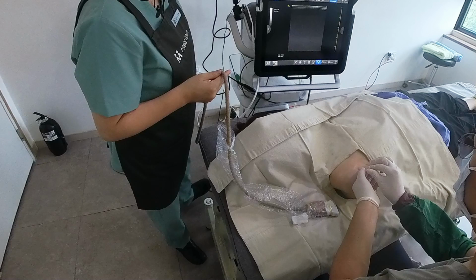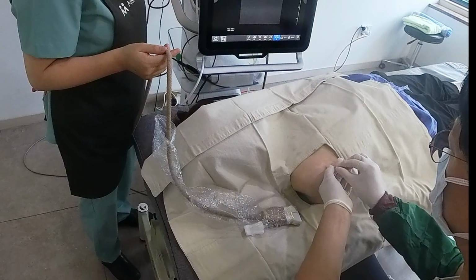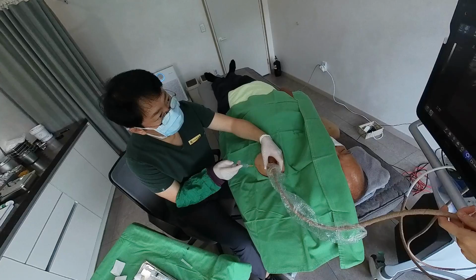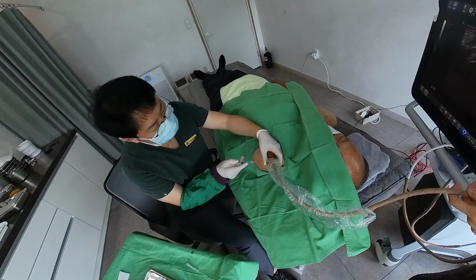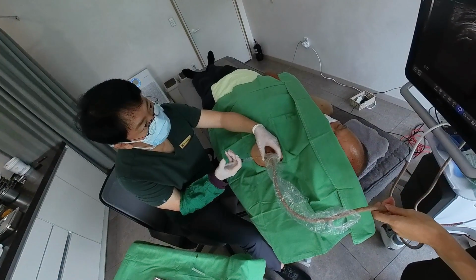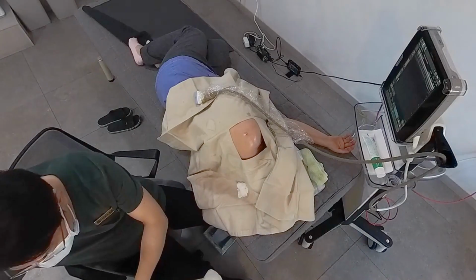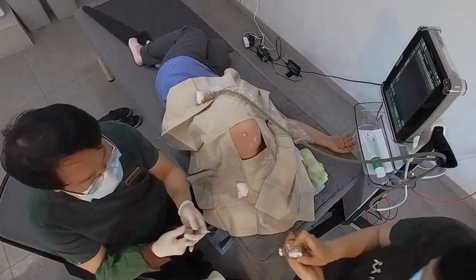Procedure steps. Patient positioning. Depending on the lesion's location, place the patient in the appropriate position. External rotation for subscapular lesions, internal rotation for anterior supraspinatus lesions, and the arm sling position for posterior supraspinatus lesions. For infraspinatus lesions, an oblique supine or lateral decubitus position is recommended.